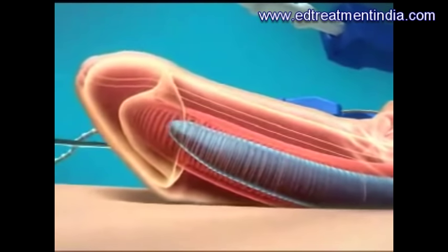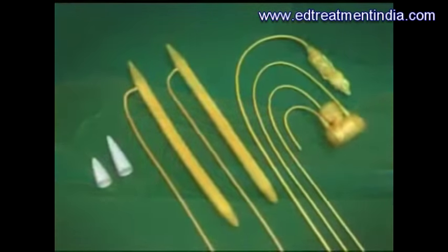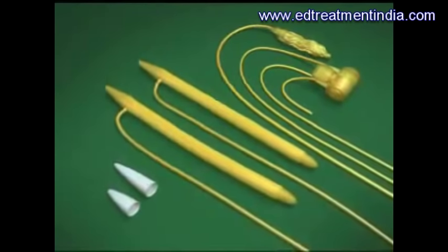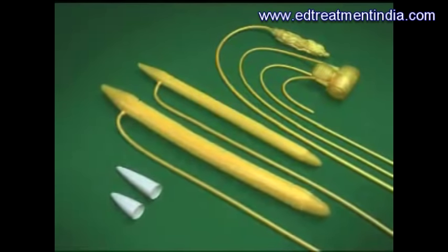The prosthesis consists of a pair of cylinders, a pump, and a fluid reservoir. One of the cylinders is inflated to demonstrate that it increases not only in diameter but also in length.